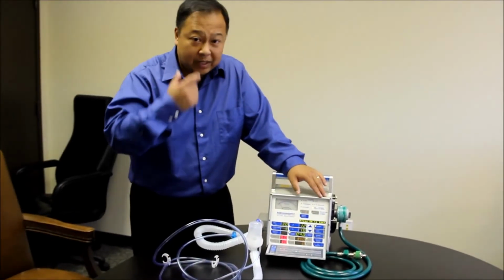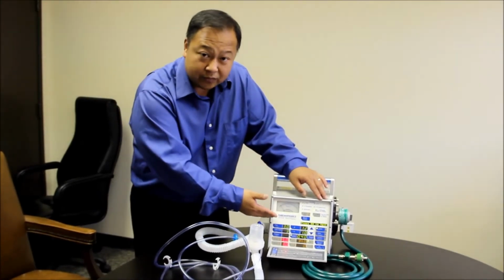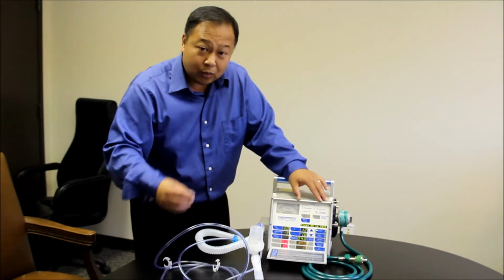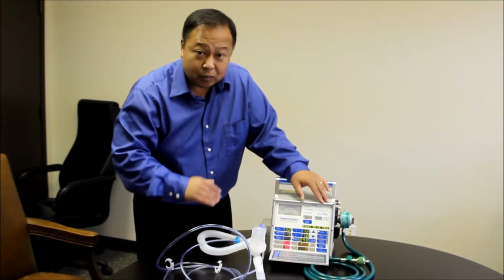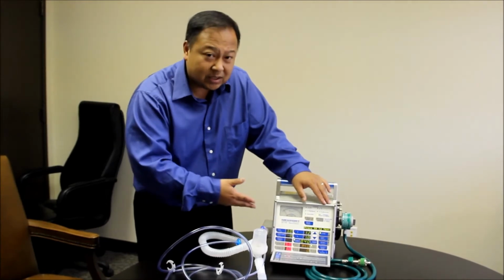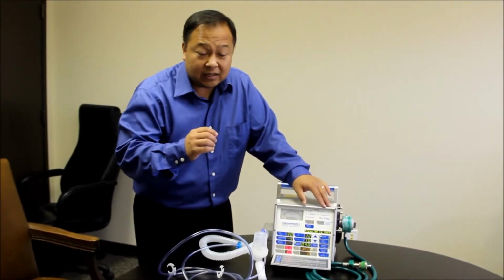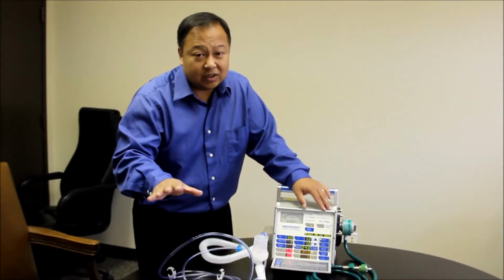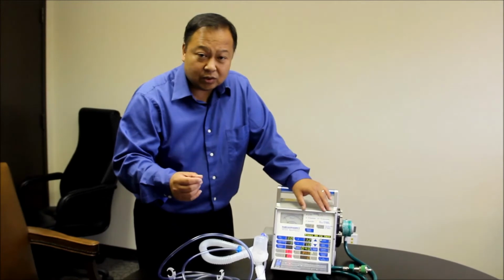So let's say, for instance, the patient breathes 16 times a minute. It's set at 12, but what about those other 4 breaths? Well, each time the patient triggers the machine, it'll give them 400 tidal volume regardless of how much they need. So that's the specific difference of AC mode, that every breath that the patient takes, it'll deliver the full breath. So that's the assist control mode.